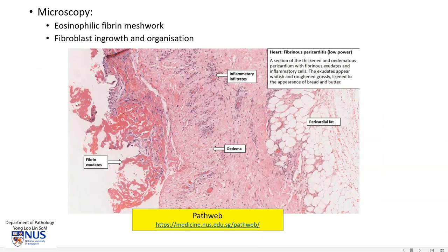Microscopically, this shaggy material that we see on the pericardial surface is actually fibrin, and we are seeing this meshwork of dark eosinophilic fibrin strands. There is also sometimes an ingrowth of fibroblasts that help eventually with organization.